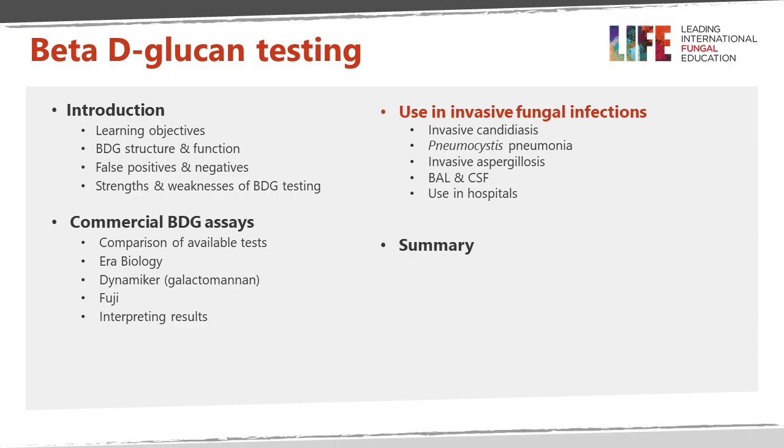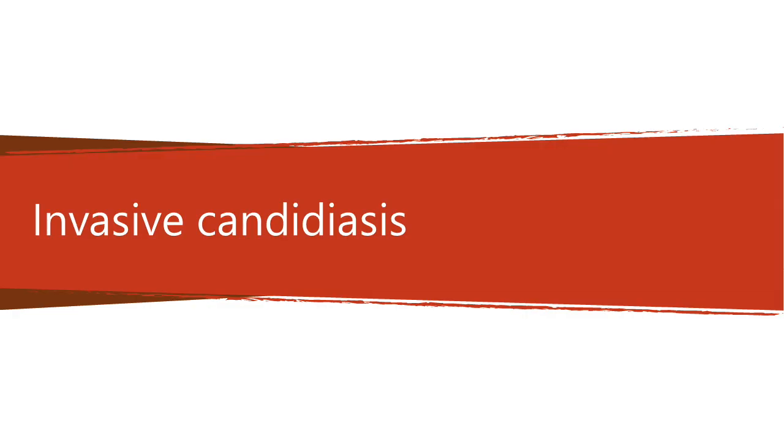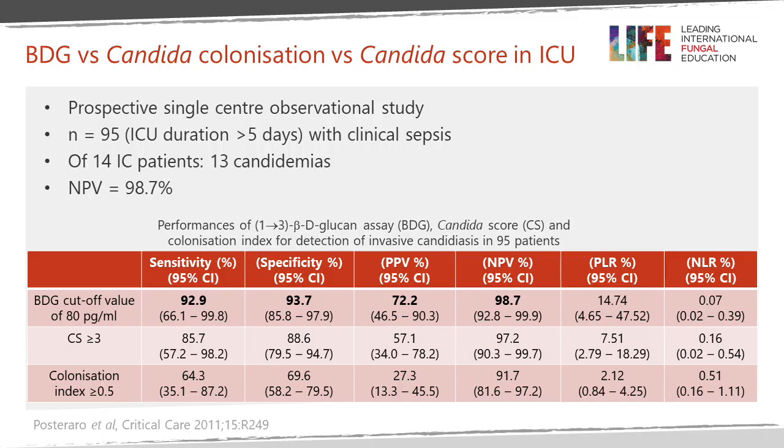So first I'll address invasive candidiasis, and I'm going to show you various studies to illustrate the statements that I've made about how to report the result. So this study, published in 2011, was a prospective single-center study and observational. 95 patients with sepsis were identified, and of those, 14 had invasive candidiasis, and 13 of those a positive blood culture for Candida.